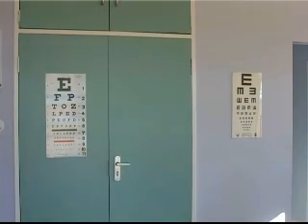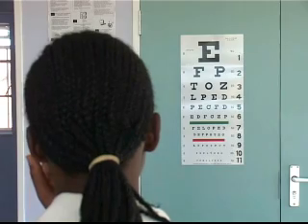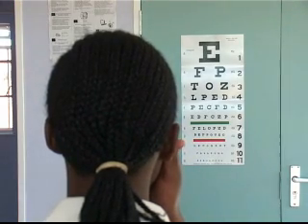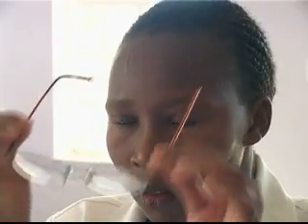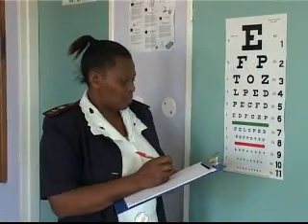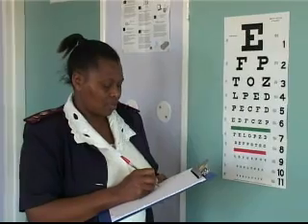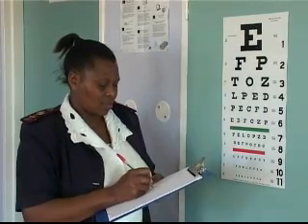Make sure that the Snellen chart is well illuminated. Position the person to be tested 20 feet, or 6 meters, from the chart, either standing or sitting. If the person normally wears distance glasses for driving or watching TV, he or she must wear these glasses for the test. The right eye is tested first, by convention. The left eye must be occluded by either the examiner or the patient. Establish the line on the chart where the person can read more than half the letters correctly. Record the vision, and document whether the vision was tested with glasses or without. Repeat the procedure for the left eye.